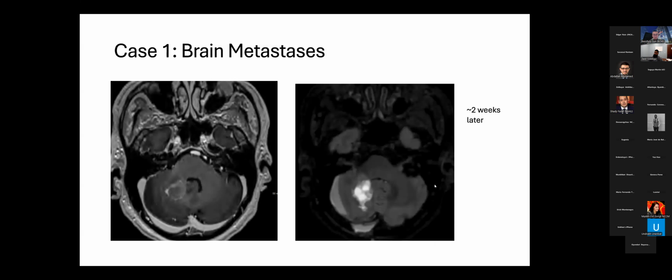And so that brings me to the next point, which is basically we have this 2-week rule. We use 2 weeks from the time of surgery to plan radiosurgery. 3 weeks is also appropriate. And we also try to deliver treatment within 2 weeks of the MRI. So once we get the planning MRI, which is 2 weeks after surgery, we try to deliver treatment within 2 weeks, ideally much sooner.